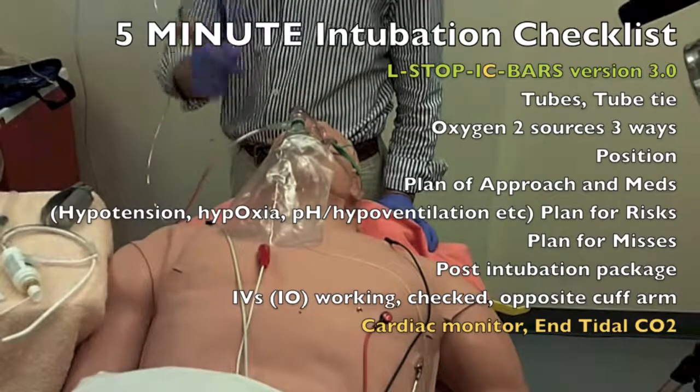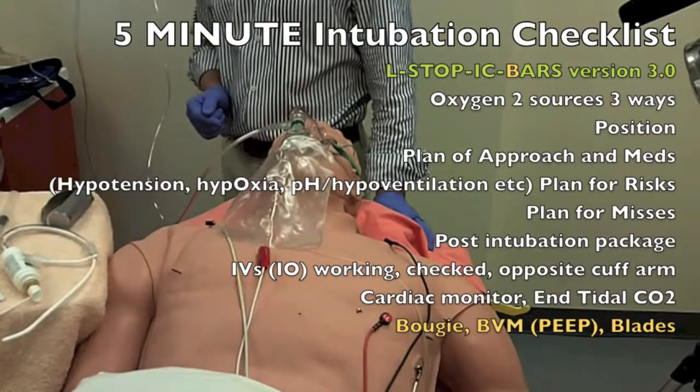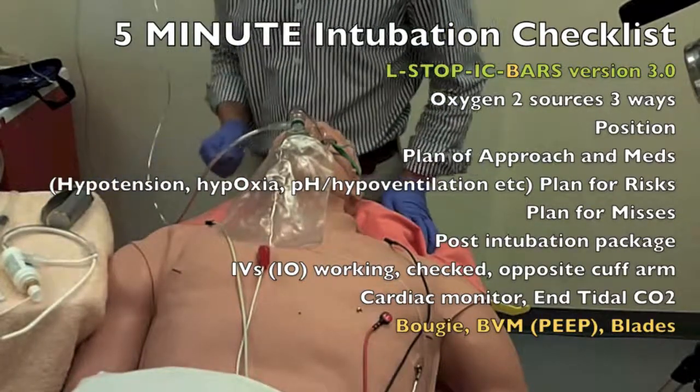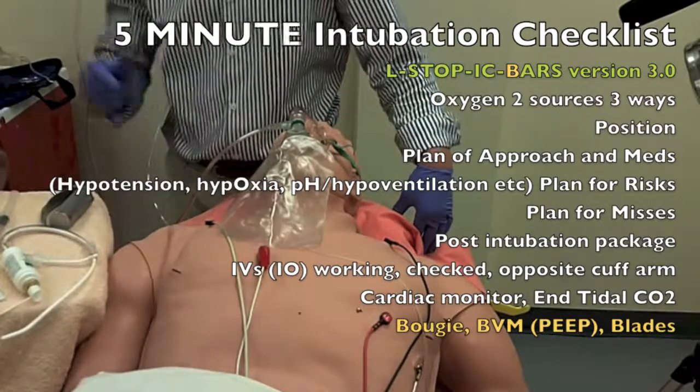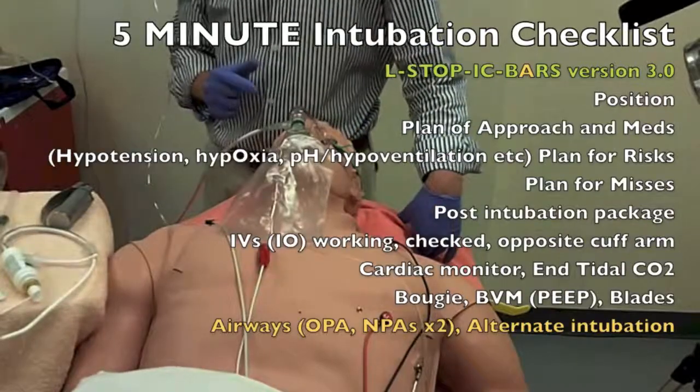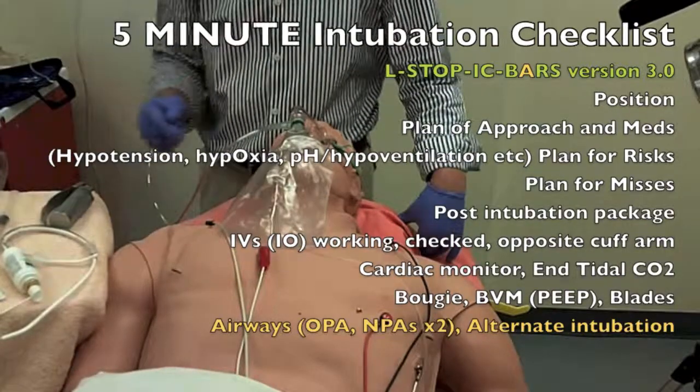Okay, and we've got monitors on. Check. All right, we've got the bougie. Bougie, yeah. BVM, check. And we've got some PEEP on the BVM. Yeah, we've got that. Okay, great. We have extra blades. And airways: we have oral and nasal.